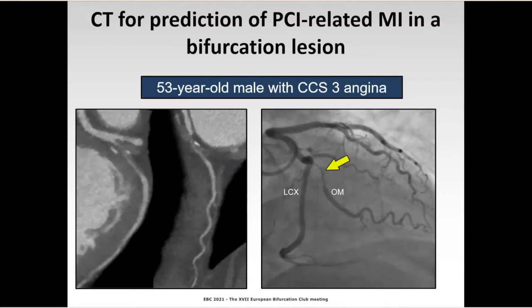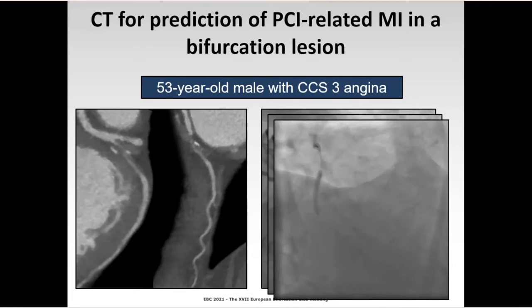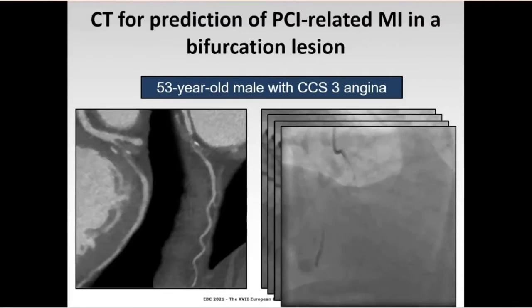Here you can appreciate this ugly-looking low attenuation plaque with positive remodeling and spotty calcium that was actually referred for PCI. However, after stent implantation, the no reflow phenomenon was observed and subsequent troponin rise was reported.